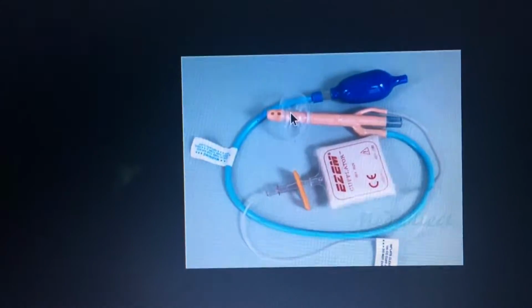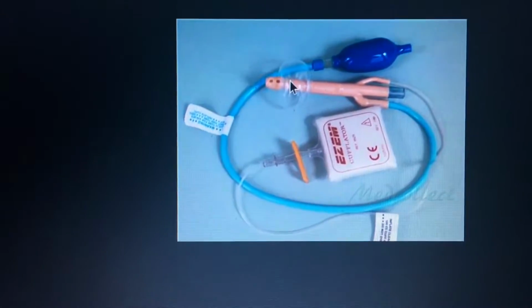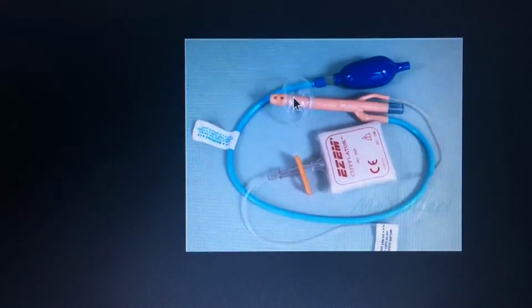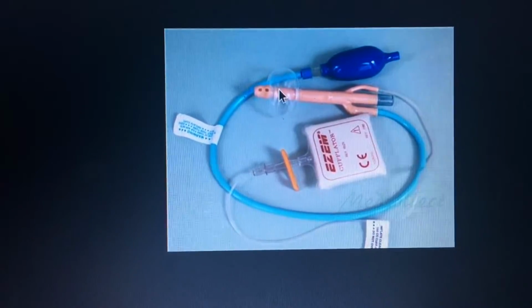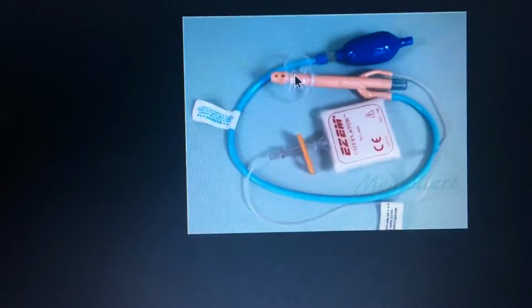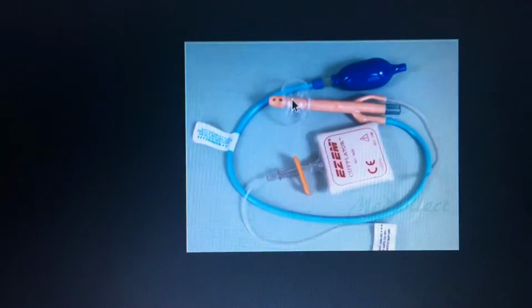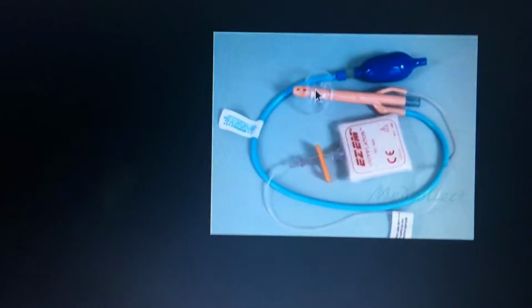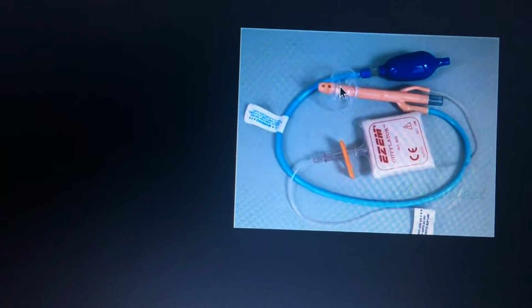And for the first image, before inserting the tip, we want to make sure that the patient has been properly prepped. They should have a clear large intestinal tract route. There should be no fecal matter. Also, you want to make sure that the patient hasn't had any surgery. Make sure that there isn't any perforation. Otherwise, we'd need to use gastrografin or some kind of iodine that is water soluble. And I believe that goes over the first 7 minutes.